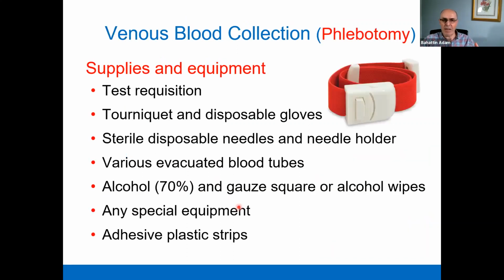These are the supplies and equipment that you need, which we also watched in the videos. The test requisition is important because you don't know which test tube to choose otherwise.